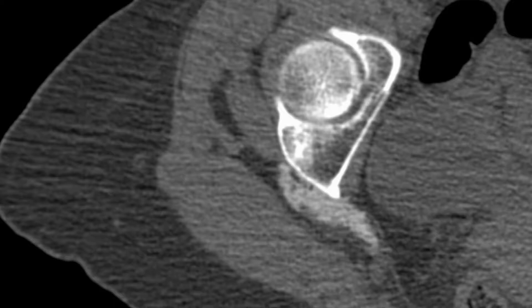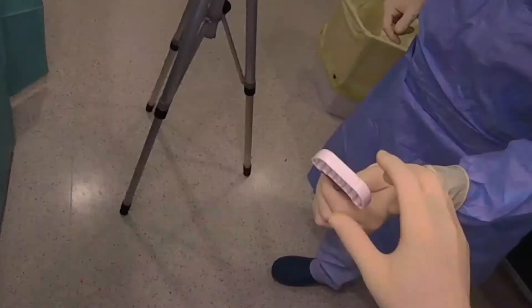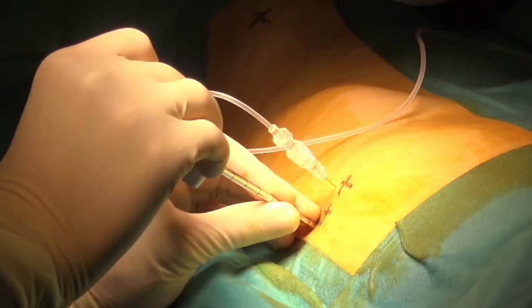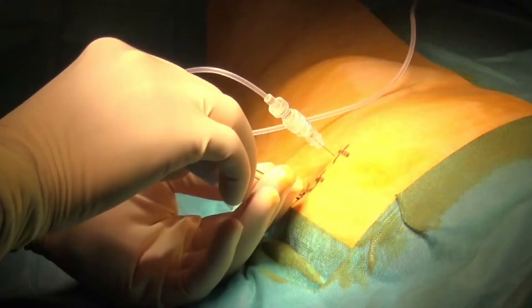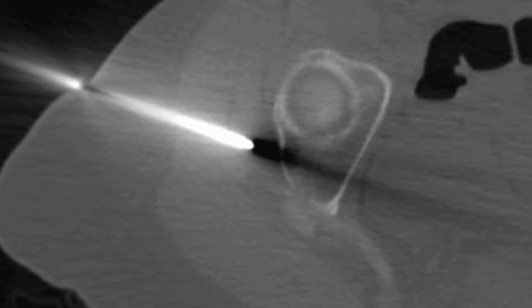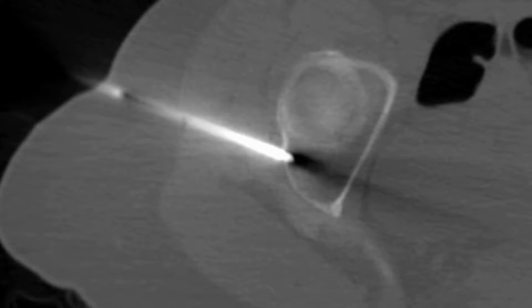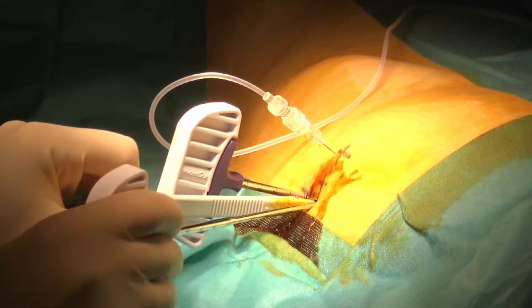Now that the nerve is effectively protected, we can proceed to insertion of the bone trocar. To achieve complete ablation with safety margins, a simultaneous dual probe approach will be used. The skin is opened to introduce the first bone trocar — a 10-gauge introducer. Using a lateral approach to the metastasis, the goal is to put the first introducer at the superior part of the lesion. The tip is manually fixed inside the cortex of the bone and then further advanced using a hammer. The second bone trocar is inserted exactly the same way, parallel and inferior to the first one.